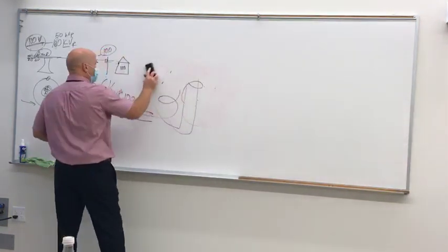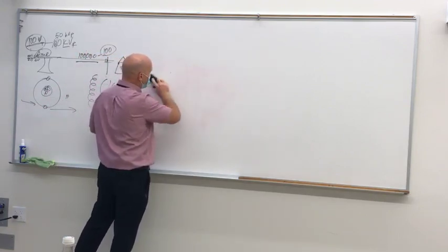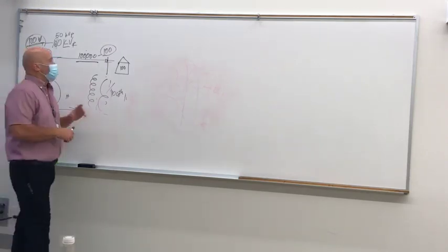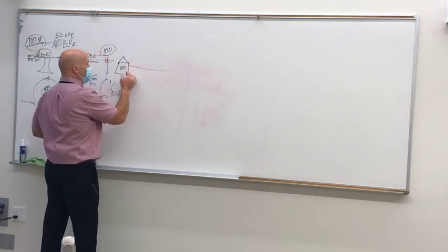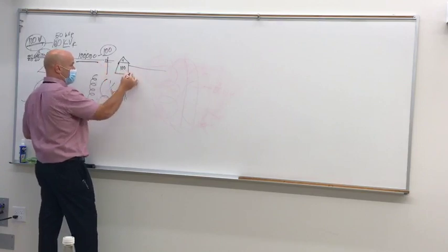100,000 volts can be very dangerous to use in everyday applications, but it's a whole lot cheaper to supply 100,000 volts. Okay. So now we have a voltage that we can actually utilize. Now this becomes a hospital. It's no longer a house, now it's a hospital.